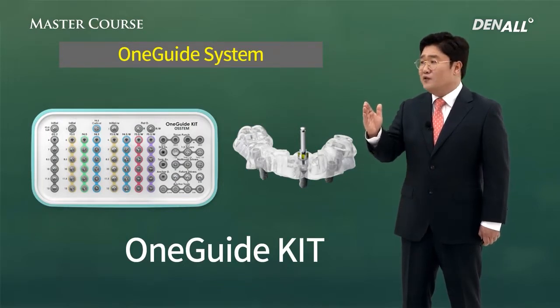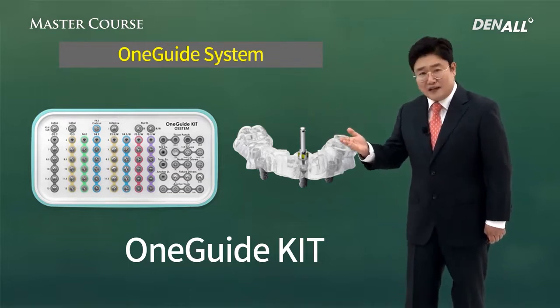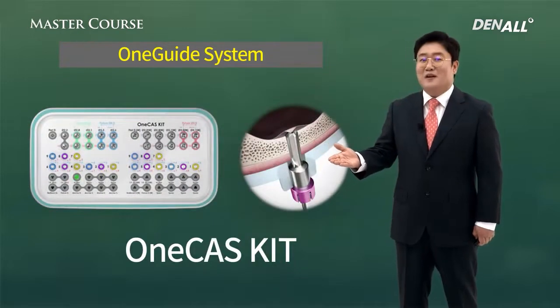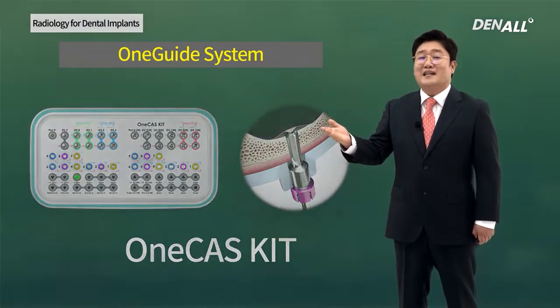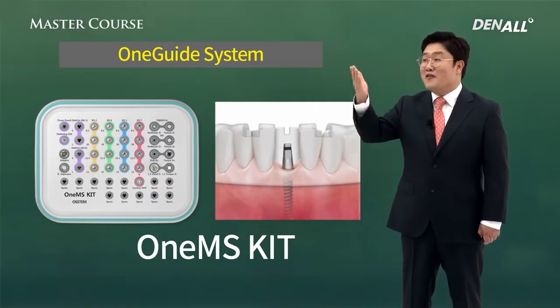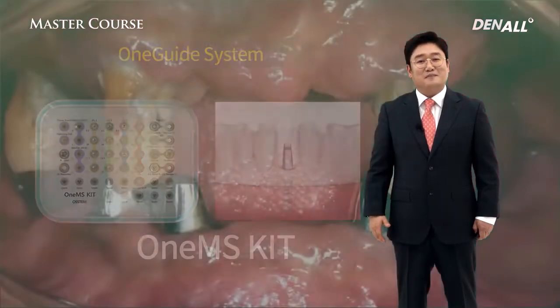After the virtual planning, digitally guided surgery can be done using this One Guide kit. It is already prepared. For sinus lift surgery, one CAS kit is absolutely necessary. And for placing thin implants, one MS kit is ready. So all those three kits are available, and those three kits will be integrated into one guide system.